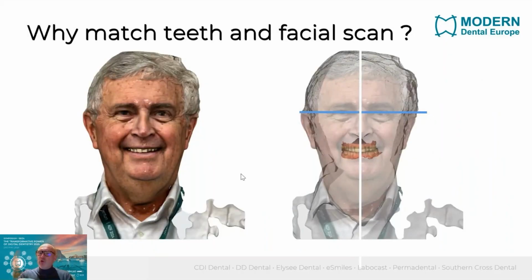Of course, the whole software as we have it, as we see it in this Rayface device, is not available. We cannot automatically align with the intraoral scans or incorporate CBCT, etc. But we can do all this in our Smile Design software, in the exocad Smile Creator.